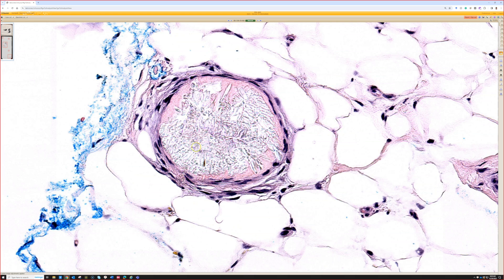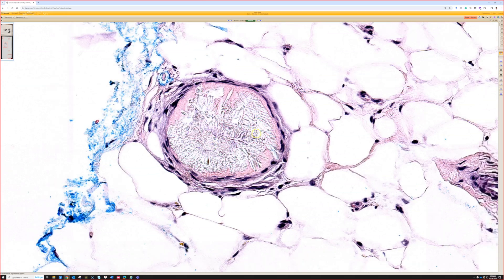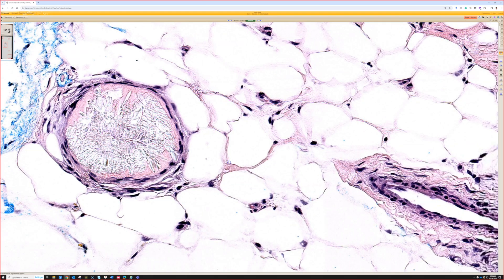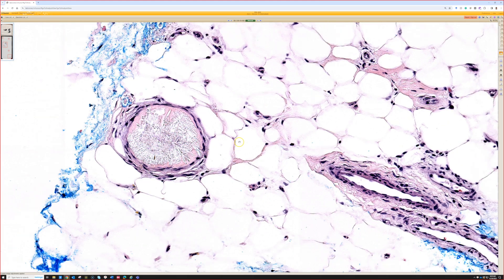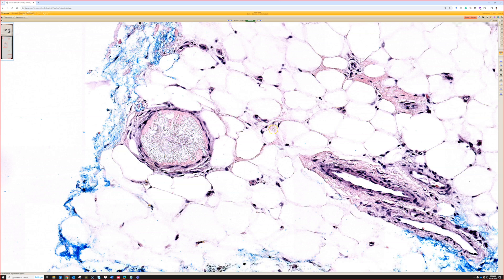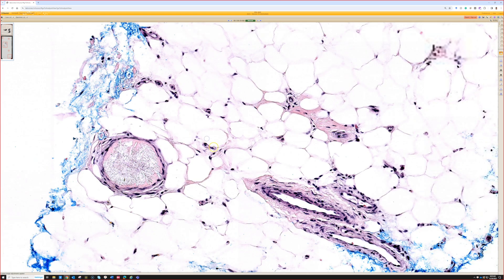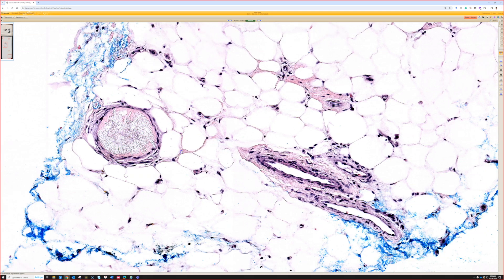You get these refractile crystals, and when you use a polarizer, they have this rainbow pattern of birefringence — it's very, very beautiful to look at. I don't think I've ever diagnosed a case of this in real life. I've just seen it; other people I've worked with have diagnosed it, but I've never had one come across my scope where I recognized it upfront.